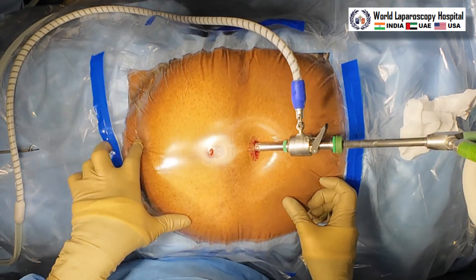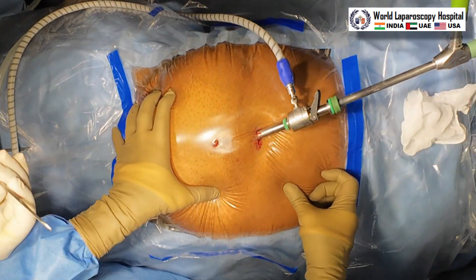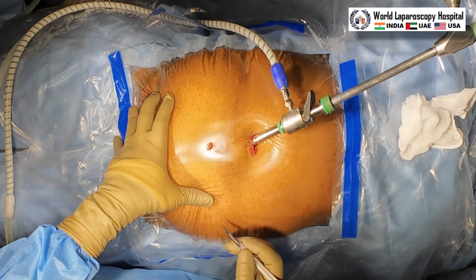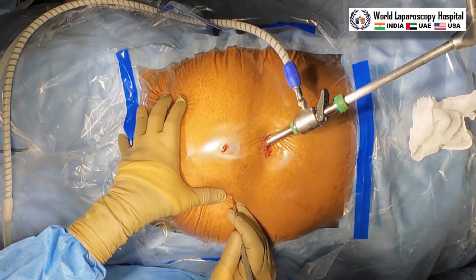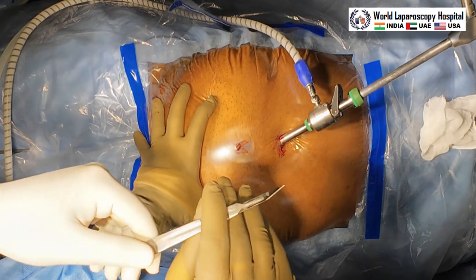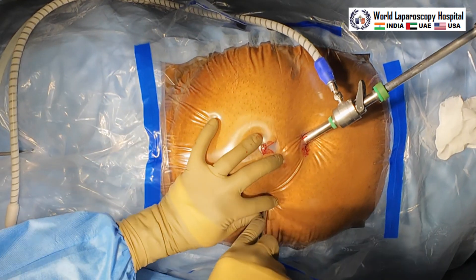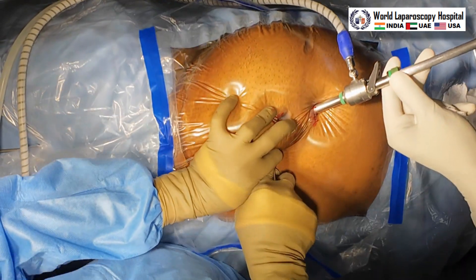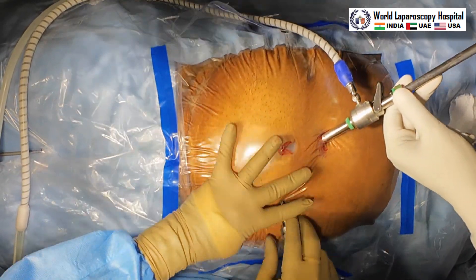Here we will perform only two ipsilateral ports: one is 7.5 cm lateral, and again one is 7.5 cm lateral and below. The table of the patient will be tilted head down slowly. This is the steep Trendelenburg position — 30 degrees head down will be introduced. After that we will enter inside and start the procedure.